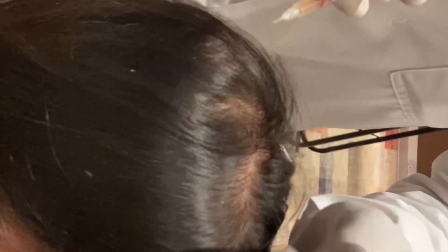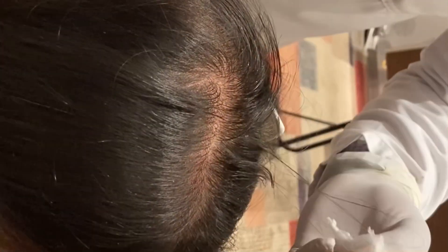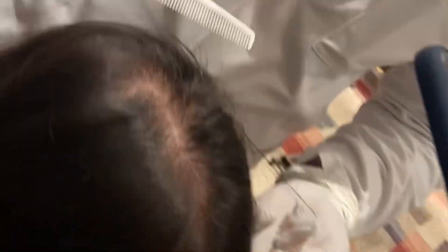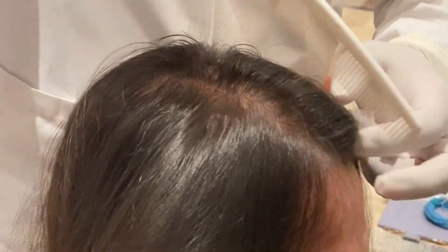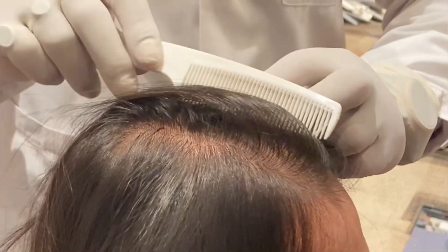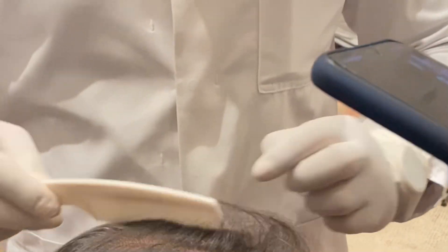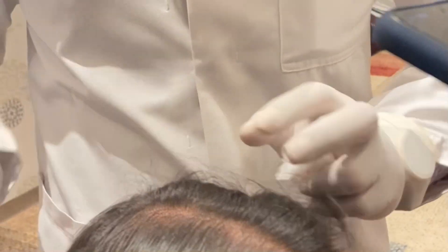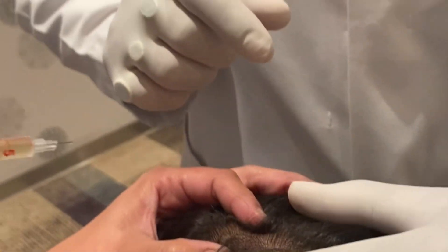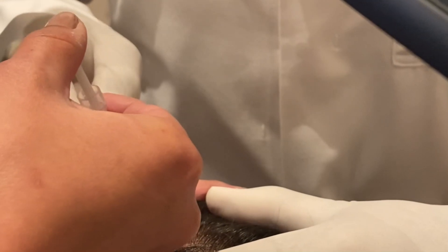And that's it. You don't have to push the needle further actually. Squeeze it and then — a little bit.